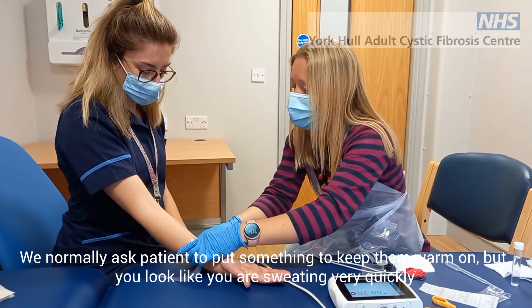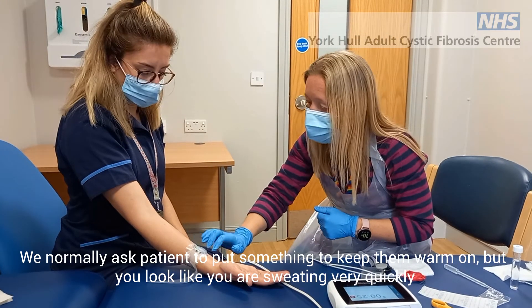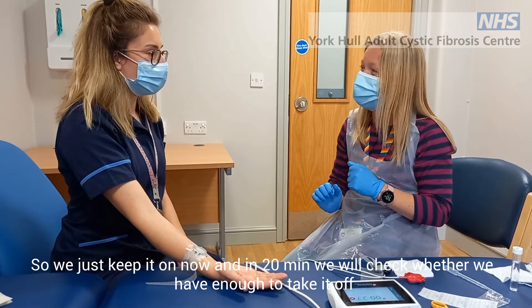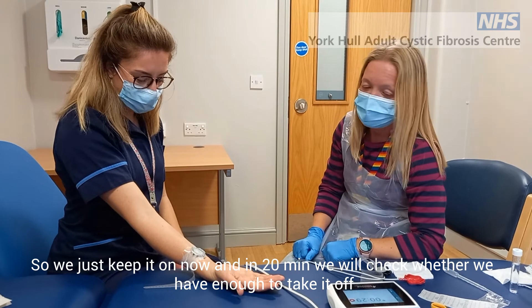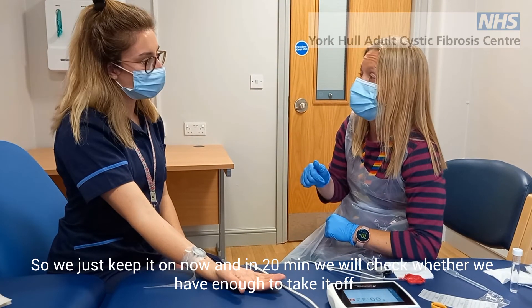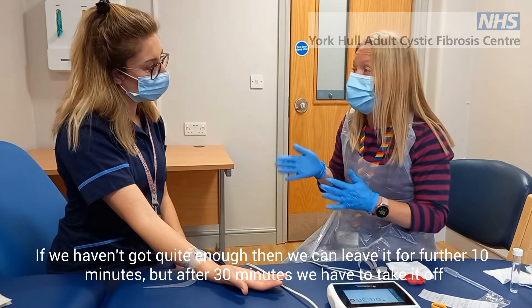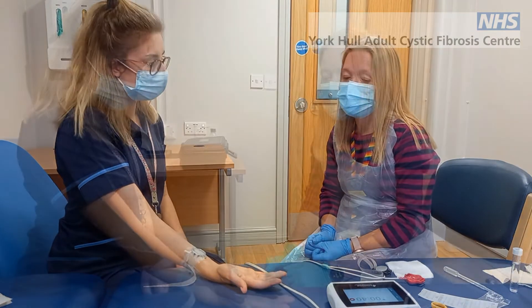We ask patients to pop a jumper or coat on to keep them warm. It looks like Laura is sweating pretty quickly. So we'll just keep this on now — in 20 minutes we'll check if we've got enough to take it off; if not, we'll leave it for up to 30 minutes, and after 30 minutes we have to take it off.